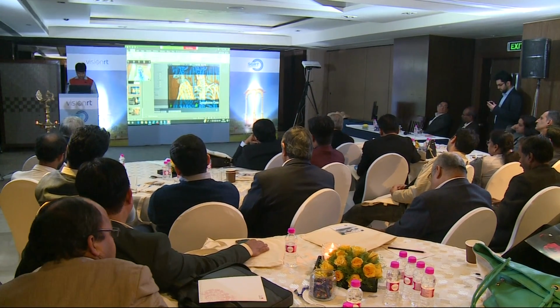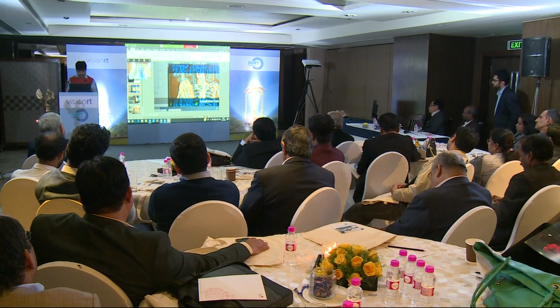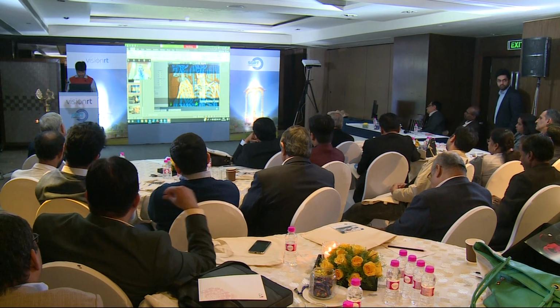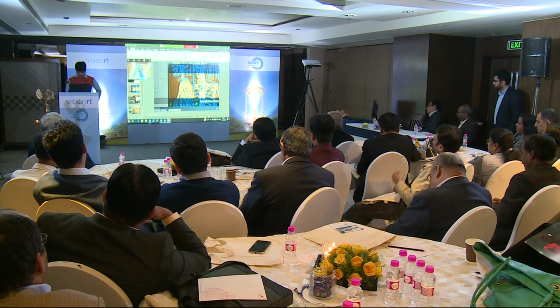but the posture of the chin, the neck, the shoulder, and essentially the rib cage is all correct, and this is one image. You've now done what you would normally do in 10 to 15 minutes worth of in and out of the room with imaging in a matter of about 1 to 2 minutes.